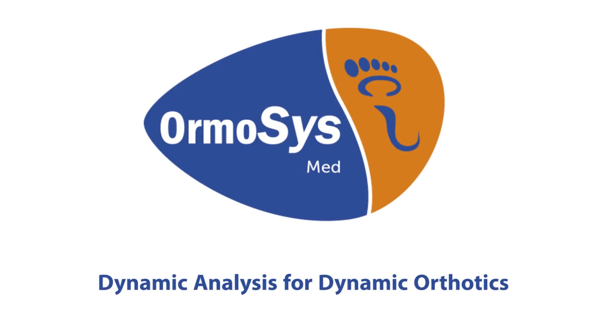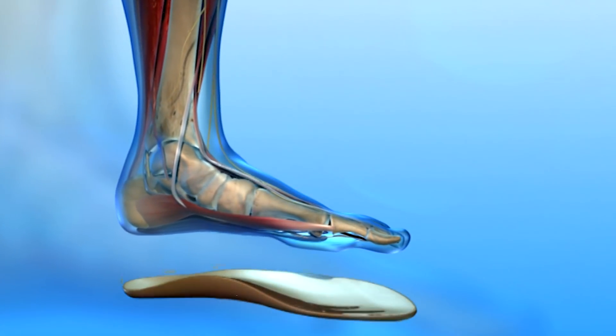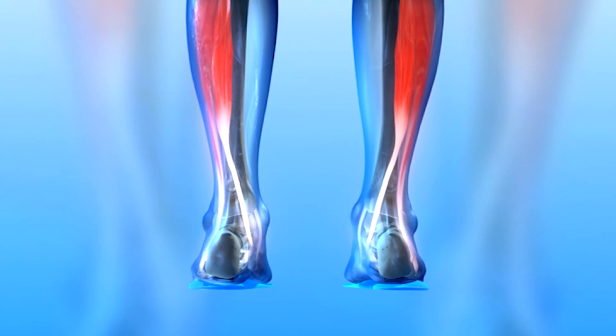OrmoSys — the new orthopedic module insole system by Fatmia Langmeier, German master craftsman of orthopedic shoemaking. This system allows orthotics to be made easier, more accurate and more personalized than other techniques of orthotic manufacturing.